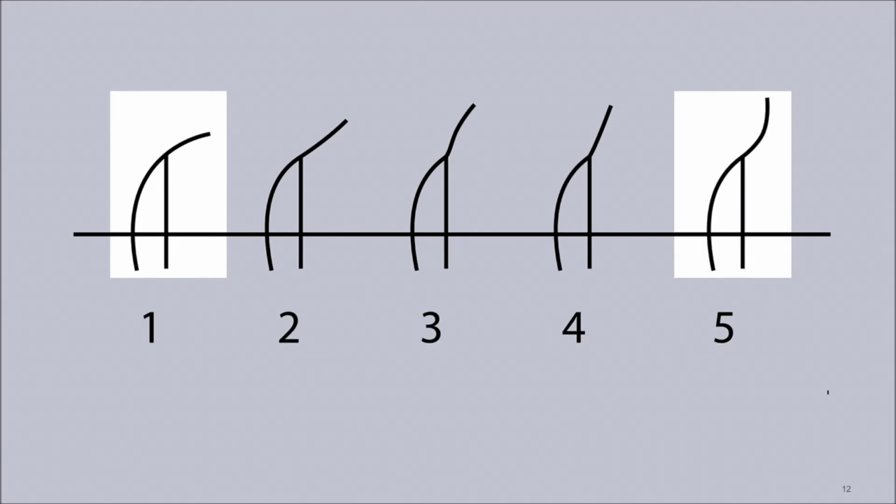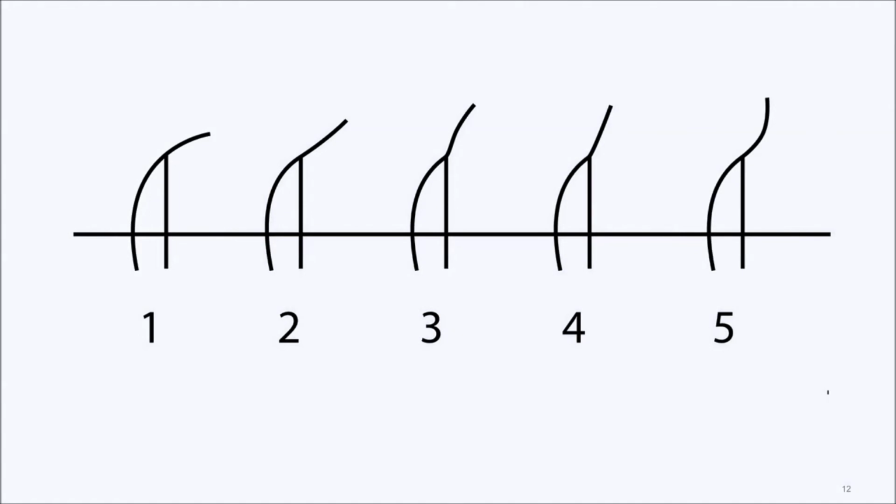And so you can see that it's not only the shape and the height of the cornea that is involved in determining what the sagittal height of the lens should be, but it's also the shape of the sclera and how that will limit how far back the lens may settle on the eye.